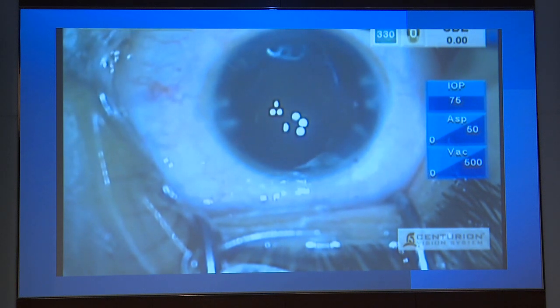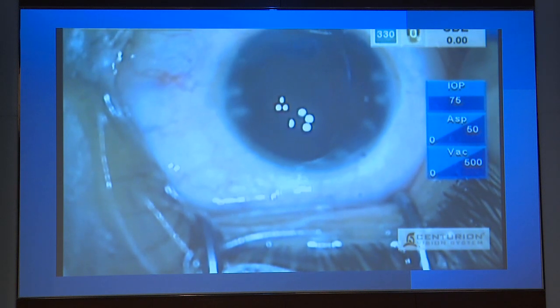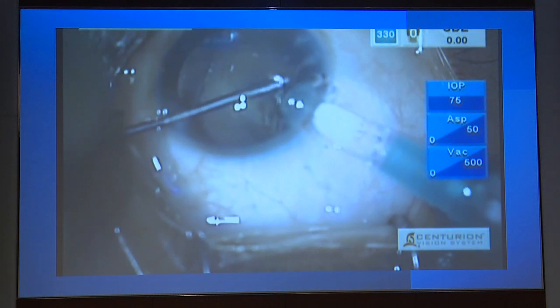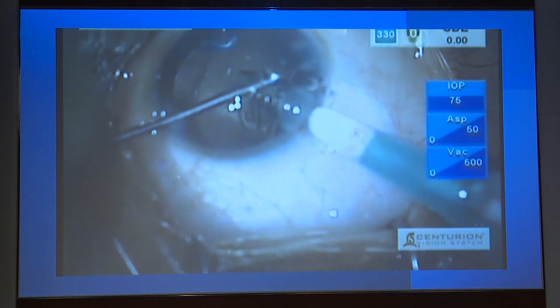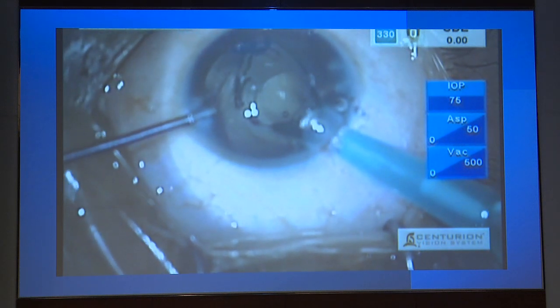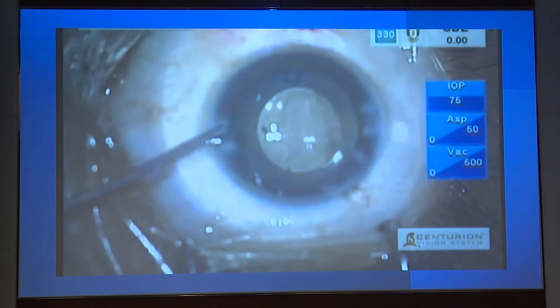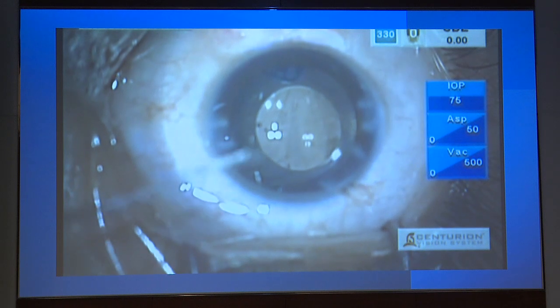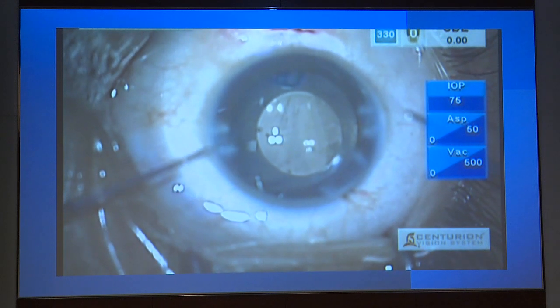Now it is time to inject the IOL gently. If you inject it ham-handedly, you might dislodge the anchor. So we inject it slowly on top of an iris repositor and then dial it carefully into the bag. Now the lens is well centered. This gives us the desired result. And the case is over.